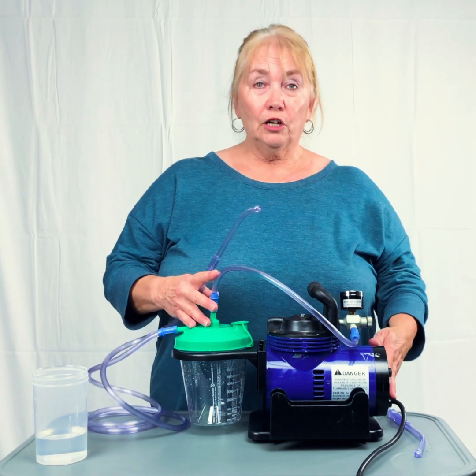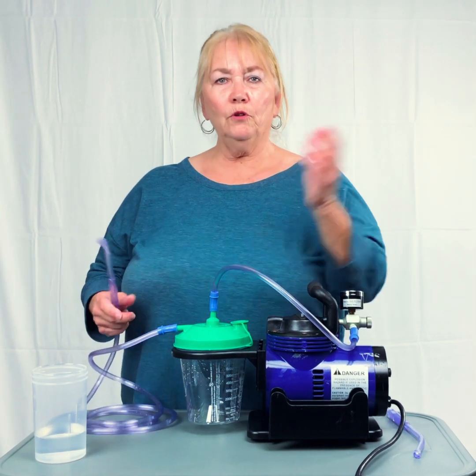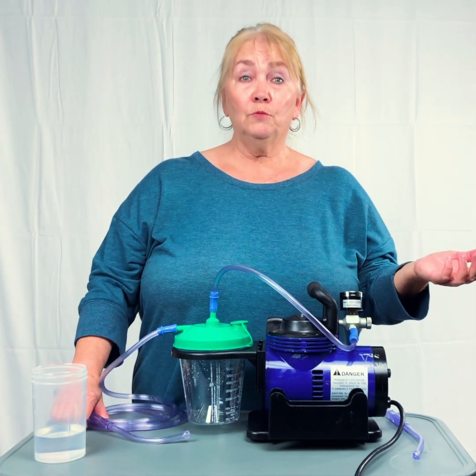Again, you start at the machine, does it turn on? Check each connection all the way through, and that'll let you know if your suction machine works or not.